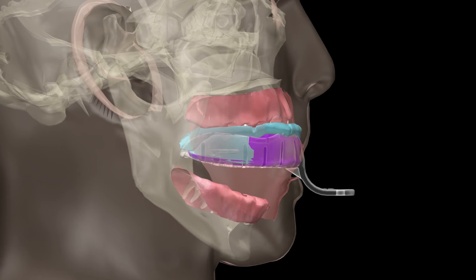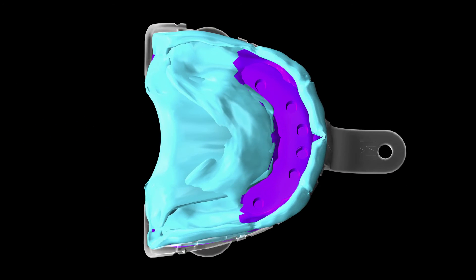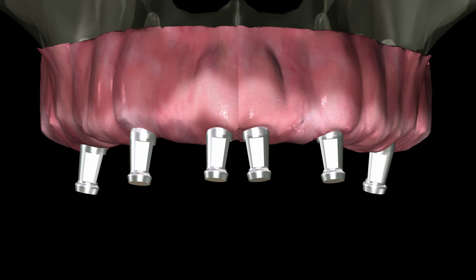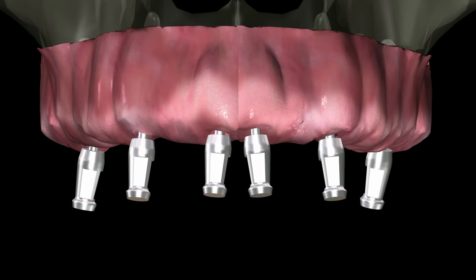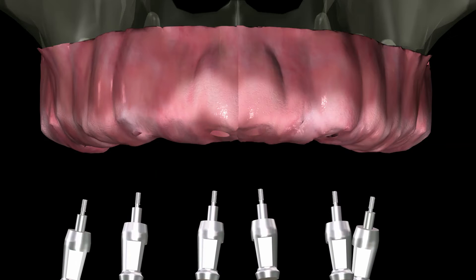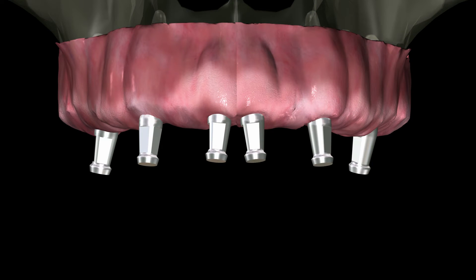When the material has set, remove and inspect. It is very important to note that each non-engaging impression coping is location-specific to each corresponding implant and must be used only with that implant due to thread time. In other words, the start and stop points of the threaded part of the non-engaging impression copings are unique to each component. Therefore, they must not be mixed up in the operatory or the laboratory.